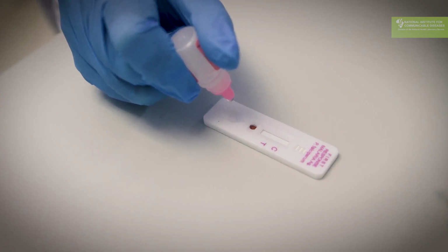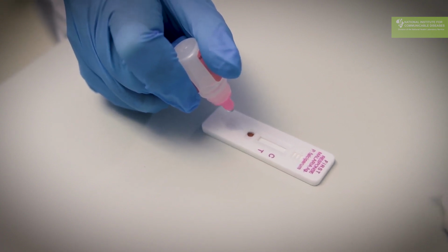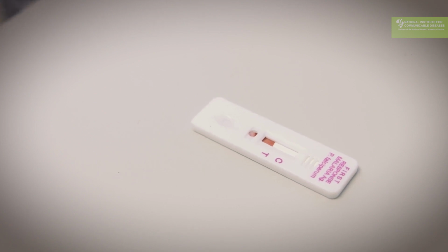Do not squeeze this like a ketchup bottle. It's very gentle, so you get 2 small drops that come out. And then you let the buffer run over the blood and through the test, and you leave the test for 20 minutes, after which you can read the test. You can maybe read the test after 30 minutes, but never longer than 30 minutes. And it should move very quickly through. And you wait for 20 minutes before you read the test.